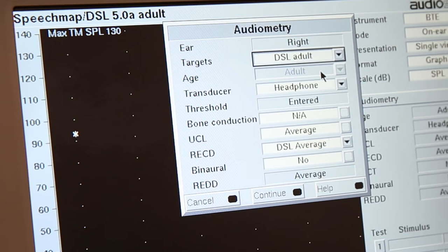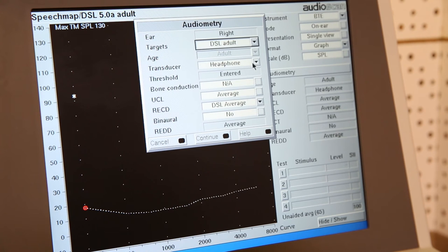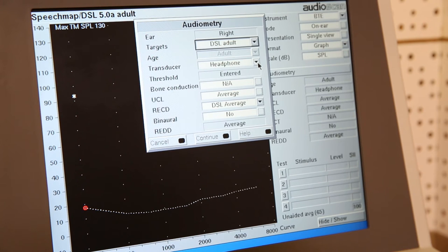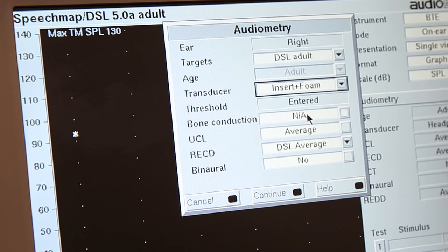You will then tell the equipment what thresholds to use, so you can choose how you obtained the threshold for the client. Most of the time you will select headphones, but in some cases, for instance, if you tested a child, you may have used insert earphones. All this information will have an effect on the target.